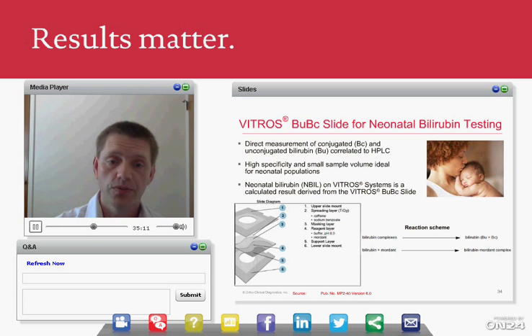So after the sample has gone through the spreading layer, which blocks hemoglobin from entering the slide as well, through the combination of it not entering the spreading layer and there being a masking layer below the spreading layer, the sample contacts what's called a mordant, which binds to the bilirubin, both unconjugated and conjugated, and actually changes the wavelength at which these molecules are read.